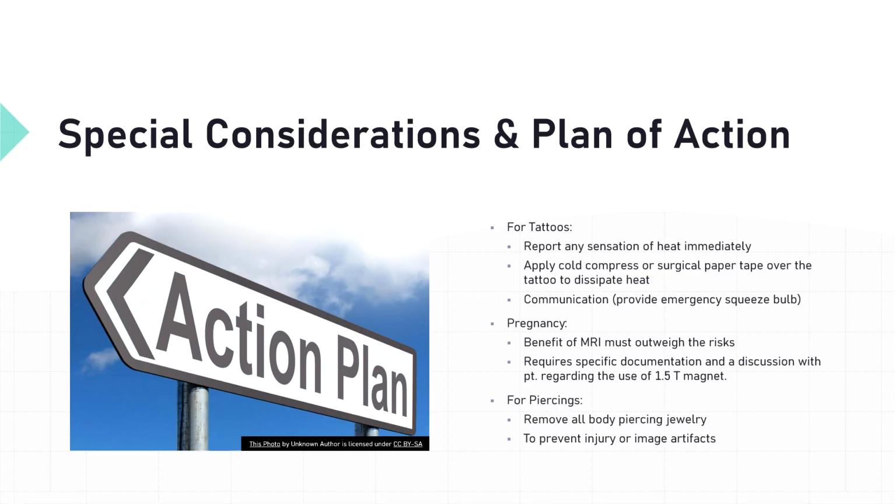To ensure Miss Jane's safety, as an MRI tech, I will implement several special considerations. First, all body jewelry must be removed before she enters zone 4. Second, I will use a cold compress or surgical tape over her tattoo if they are located within the RF field of the head coil. And thirdly, I will remain in constant verbal contact and provide her with an emergency squeeze bulb, instructing her to alert me immediately if she feels any warmth or tingling.